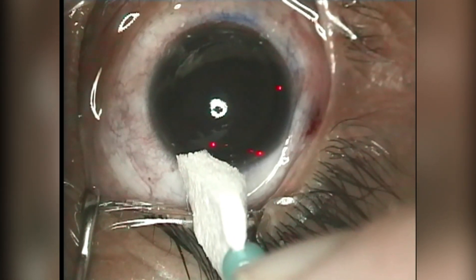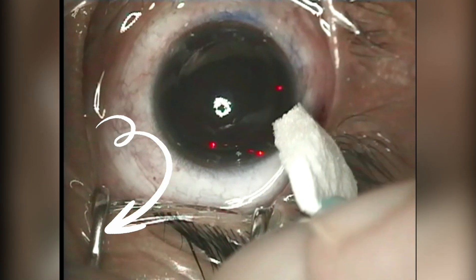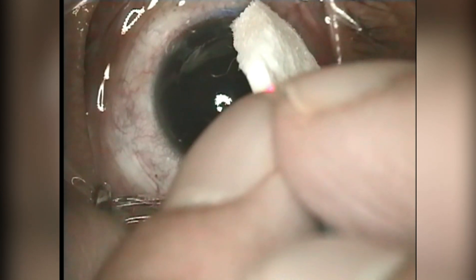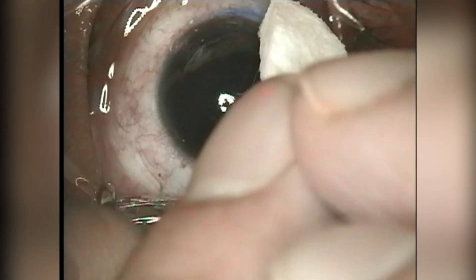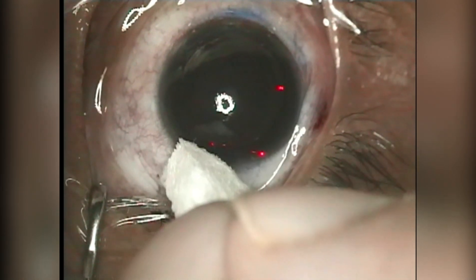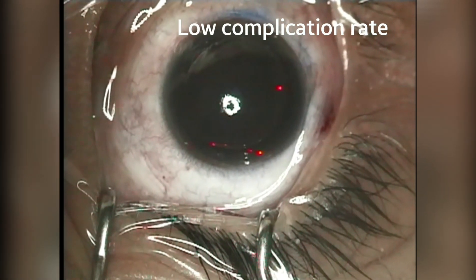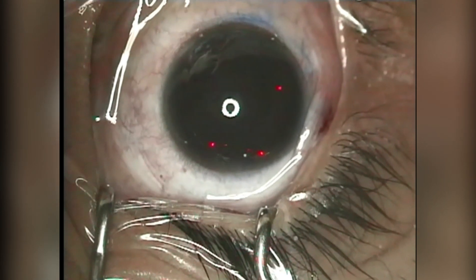Is LASIK surgery dangerous? Blinking or closing the eyelids is a common concern, but a small device takes care of that for you. The lid speculum holds your eyelids open during the procedure so you can't accidentally blink or close your eyelids at any step of the surgery. With regards to movement, many LASIK machines are built with computerized iris tracking systems that follow your eye movements. The iris tracker makes sure that the laser is fired only when safe and aborts it when the plane is out of focus. A well-trained surgeon and technology ensure that movements do not affect the result. LASIK complication rate statistics are extremely low — less than 1%. These surgical complications are very rare events, even lower now with the advent of newer machines that abolish the use of a flap maker, making the procedure safer and more efficient.